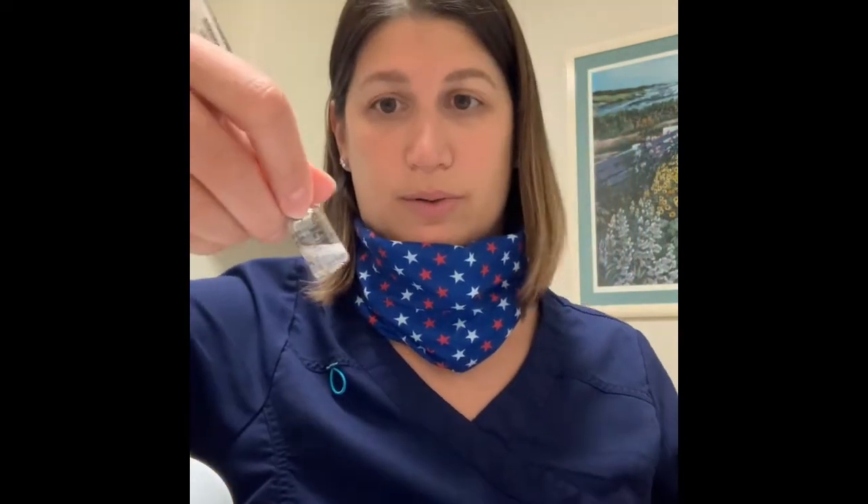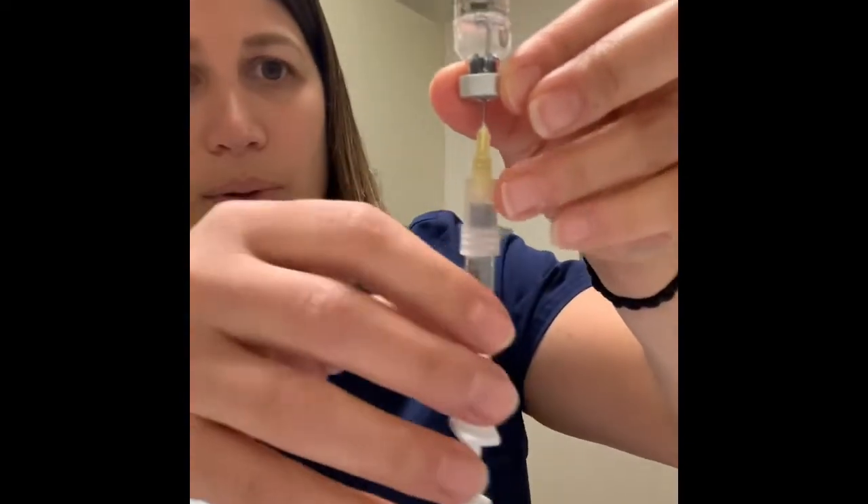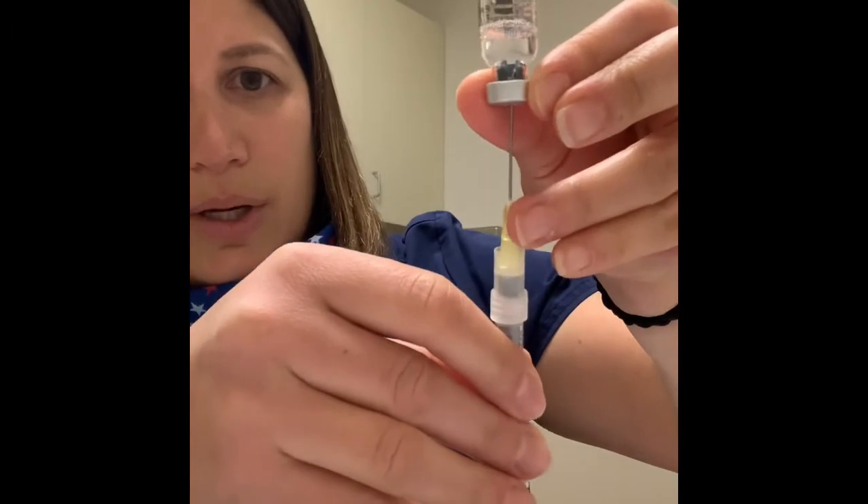Once you've injected all the fluid in, just swirl it around like the Menopur. It mixes fairly quickly. It'll be clear — might be a little cloudy initially, but basically clear with no floating particles. Once it's all mixed, pull the needle tip down into the window and pull out all the fluid you can. You're not going to get every last drop — that's perfectly fine.